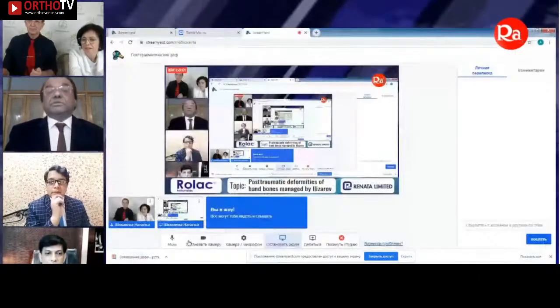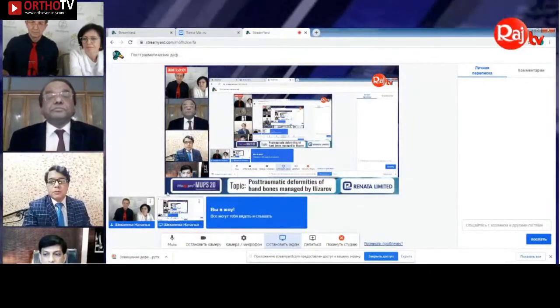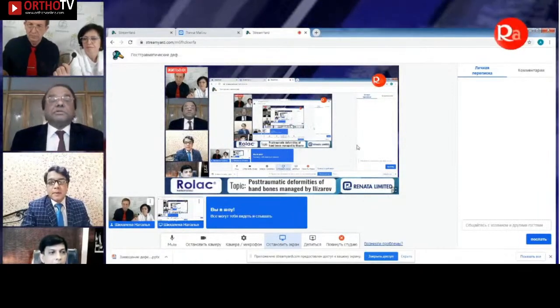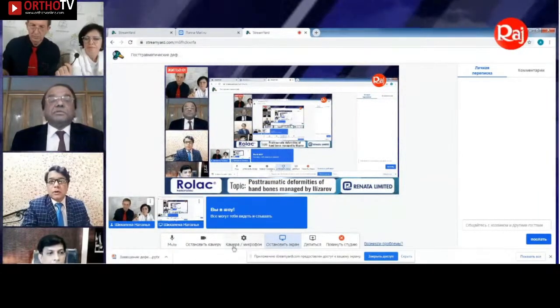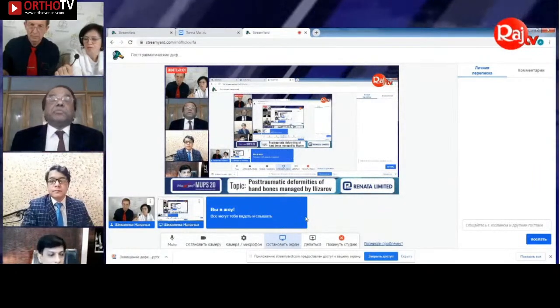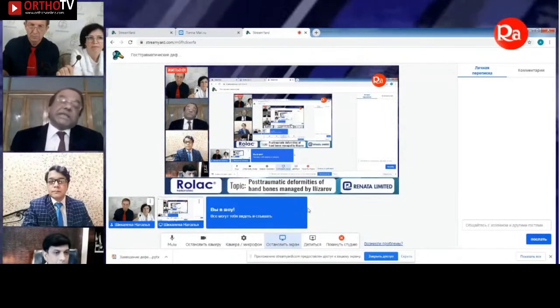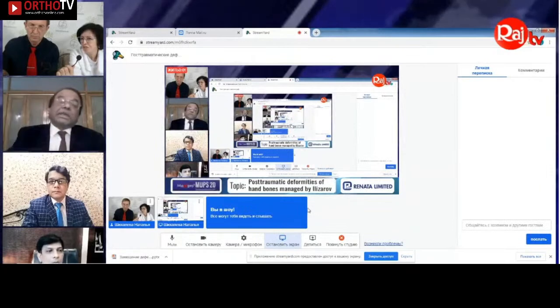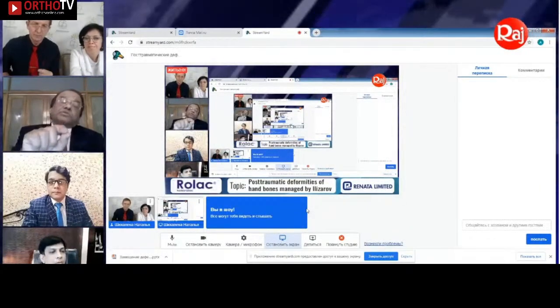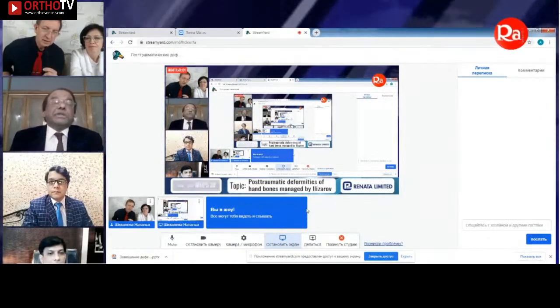Yes, sir. Okay, it's good. Sir, in case of the lengthening of bones, when we start the distraction, is it in the same pattern, just like long bones, or any other different manner there? Yes. Many Ilizarov 0.25, 0.75, even 1 millimeter, just like an adult. In case of the small bones here, the size is small. That's why you can start 2 times or 3 times.